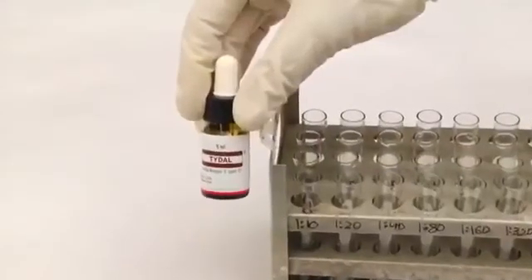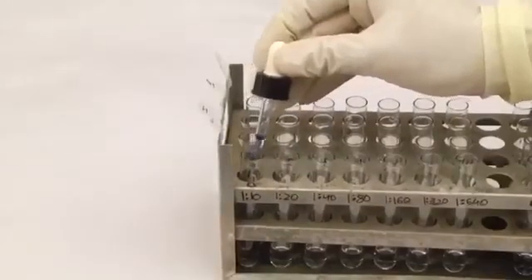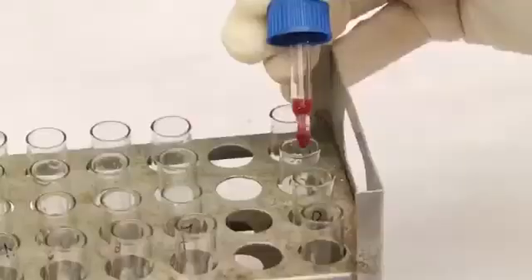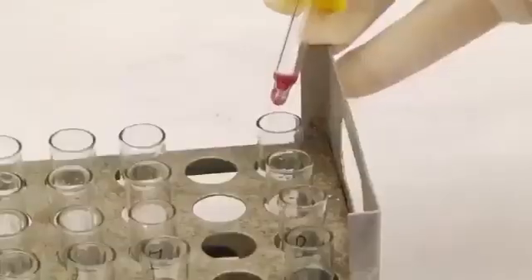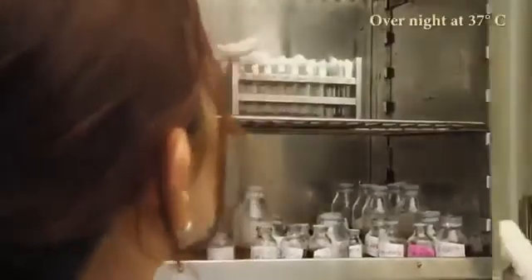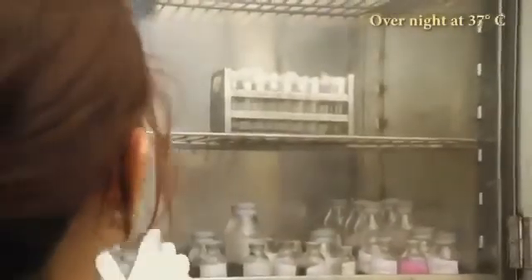To all the tubes, that is 1 to 8 of each set, add 1 drop of the respective well-mixed antigen suspensions from the reagent vials and mix well. Cover and incubate overnight at 37 degrees centigrade.